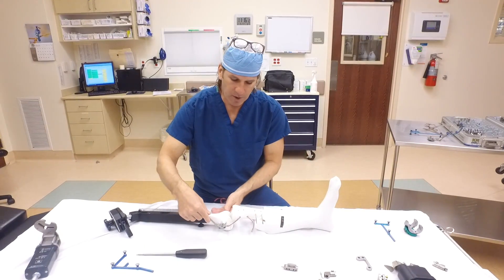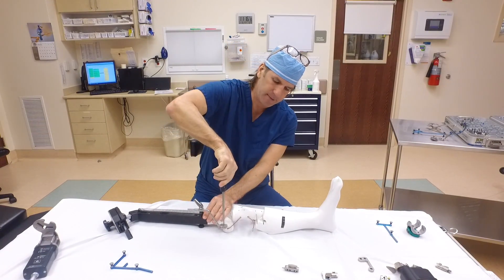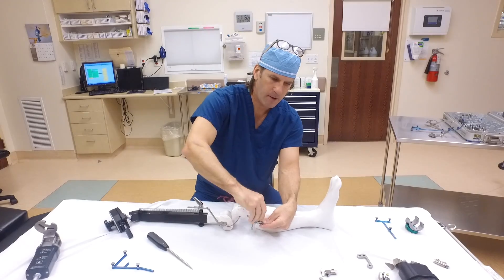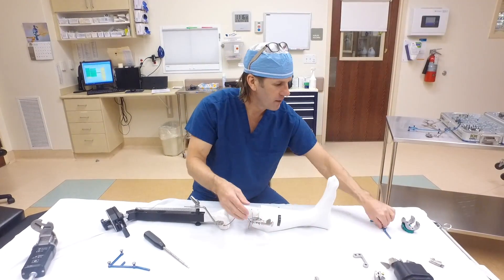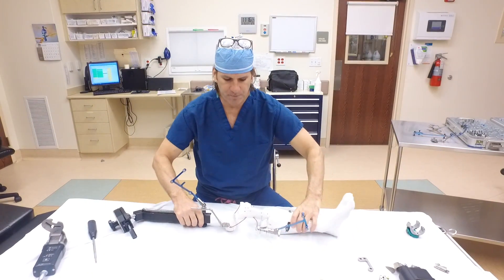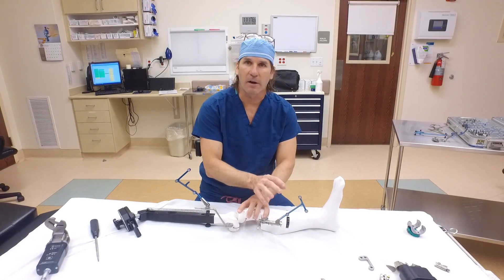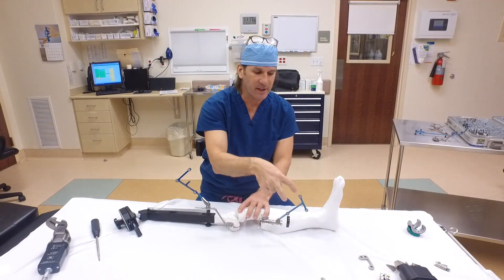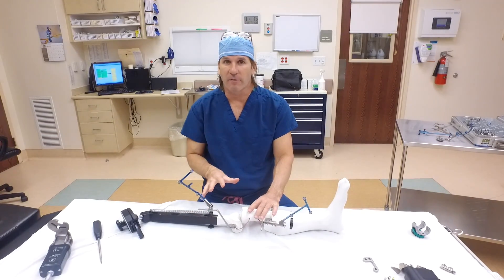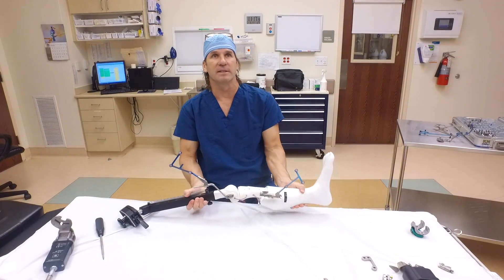Once we put the two pins in, we're going to align them with the computer. We'll screw those on and bring in the tibial tracker. It's important we get these screwed down tight, as this is how the computer will measure within half a millimeter how we're going to change the alignment of this knee. These little balls here are going to communicate with the computer — it's accurate enough to tell the difference of where everything sits. We train the computer for exactly where everything is, making sure the computer can read those pins everywhere.